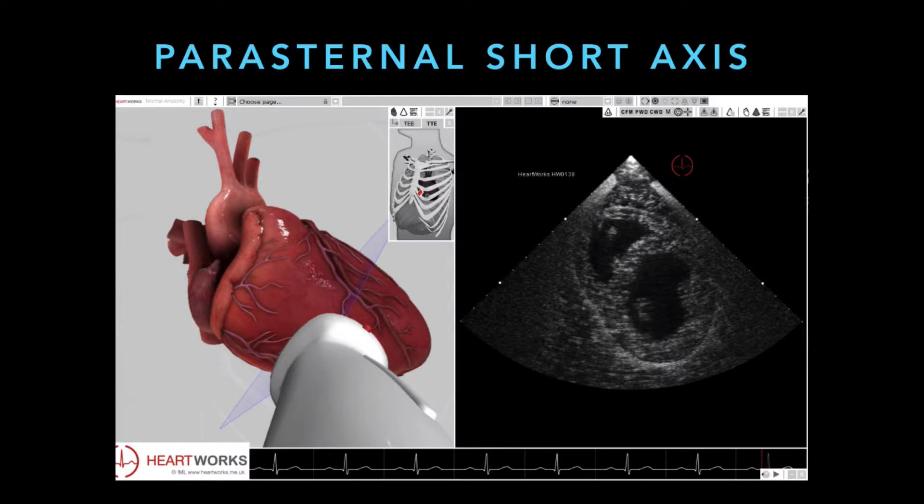For the parasternal short axis, you're using the same window as the parasternal long axis. The difference is that the indicator is now pointed 90 degrees differently, so it's going to point up towards the left shoulder or the right hip, depending on what your machine looks like. And you're going to see a circular-looking heart, like a donut.